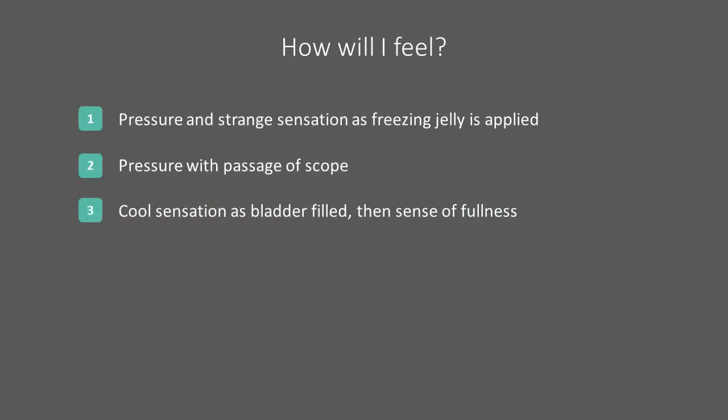You may feel anything from a cool sensation or pressure in the urethra to a slight burning sensation with passage of the freezing jelly. Some patients describe it as feeling like they are urinating backwards. You may feel more pressure with passage of the scope and a cool sensation as the bladder is filled, then a sense of fullness or a need to urinate.